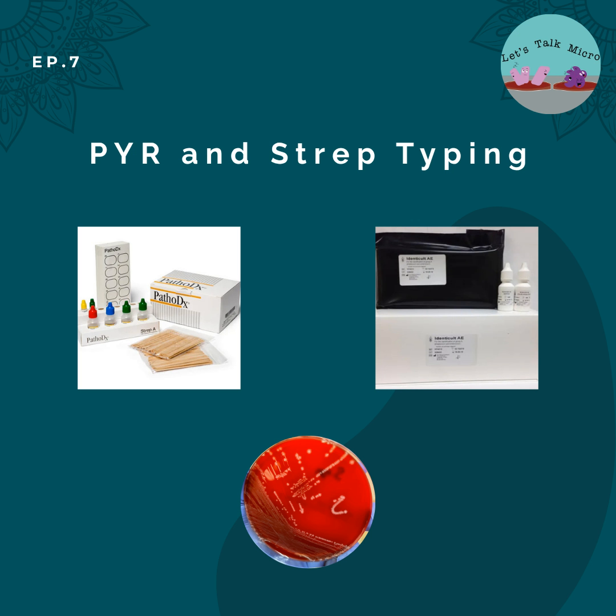Last week I posted a picture of a gram-positive cocci flowchart between clusters and chains. Very basic, starting of course with catalase, and then you go depending on the result which way to go. But it gets, you can speciate. The flowchart speciates the beta hemolytic streps based on the strep typing, which is what we're gonna be talking about today. It's a great document when you're starting in micro, so go ahead and feel free to print it and use it for your studies. That's the goal here, sharing the information, sharing what I know to make micro a little bit easier for everyone.